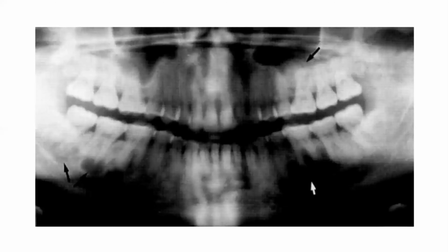Next, we have florid cemento-osseous dysplasia, or gigantiform cementoma. It usually appears in middle-aged adults. It's very rare. The site is widespread, so often in all four quadrants, whether they're dentulous or edentulous, but associated with the apices of teeth if they're present. They're variable in size, usually around 2 to 3 centimeters. There are different shapes, but usually it's round, and frequently they can coalesce within the quadrants. They're smooth but lobular, moderately well-defined but irregular.